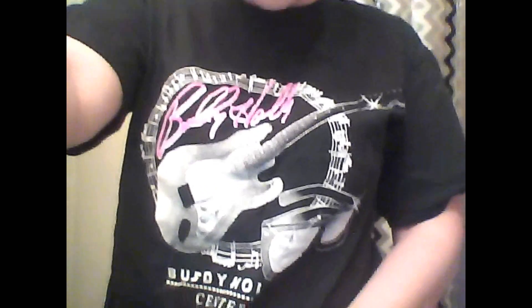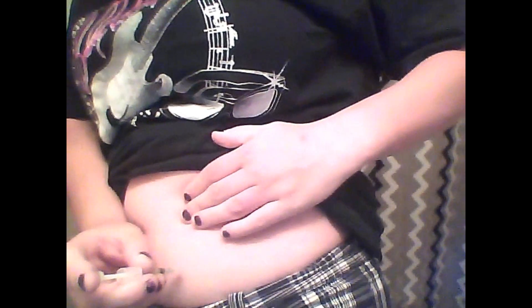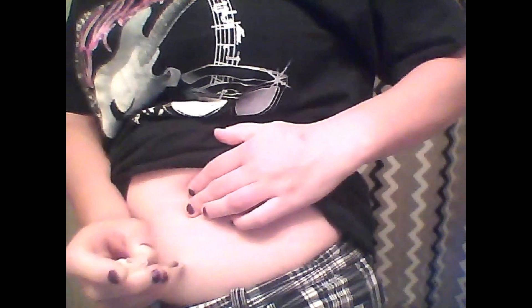Insulin smells so weird. Let me pan the camera down a little bit and show you my stomach. Basically for the stomach, same thing — you just take it and inject. And the rest of it's in there. It's gone.